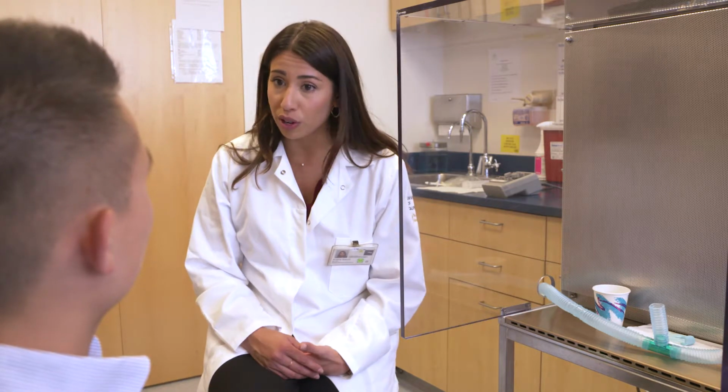You'll be breathing a mist of concentrated salt water. The salt water may make you cough and may make you salivate. We want to avoid salivations and postnasal secretions from entering into the sample, so that means that you should blow your nose and spit into the cup as frequently as you'd like. This is a 12-minute procedure in which you'll be breathing on the mouthpiece.